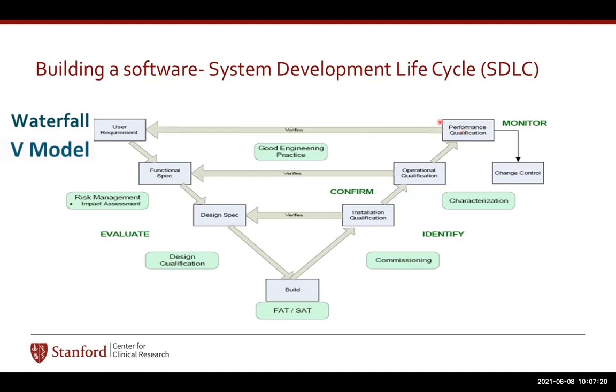And then once you have deployed a system, it is under change control. It is monitored. If you make any change, then you have to test the functionality again and see whether the change that you made impacted any other functionality. And that is also one of the important things to do. You will be surprised: I did not touch any other things, so how can they be affected? But, excuse me, they could be affected. So if you understand that, then this is the way we make a software system, no matter whether it is based on SmartSheet or an Excel file or the SAP system.